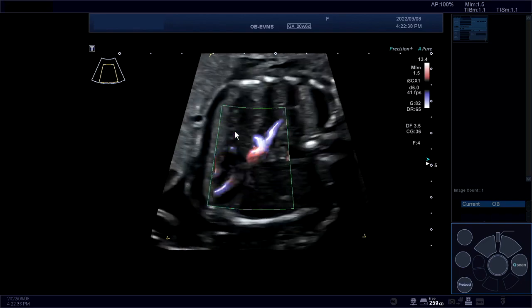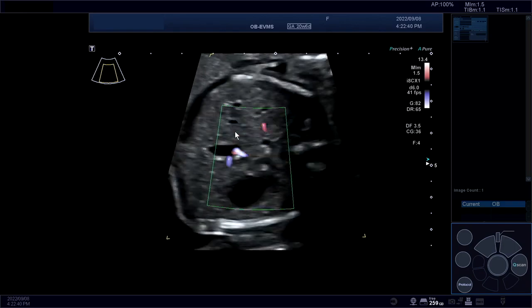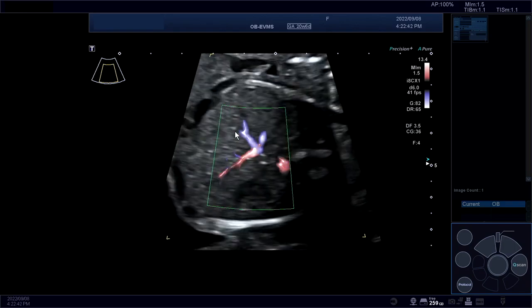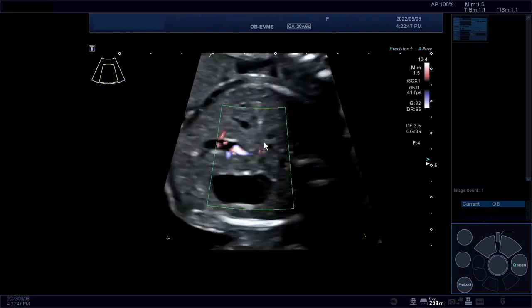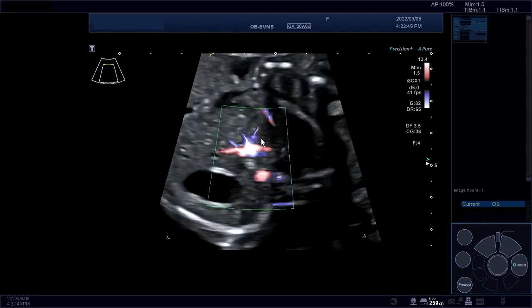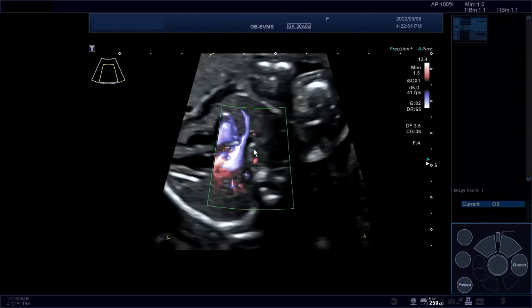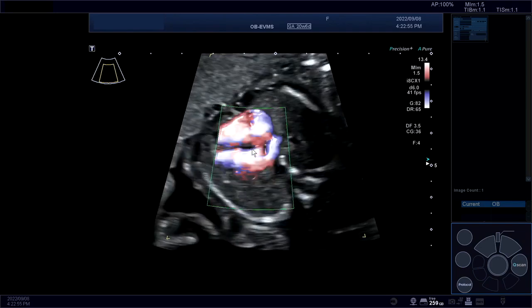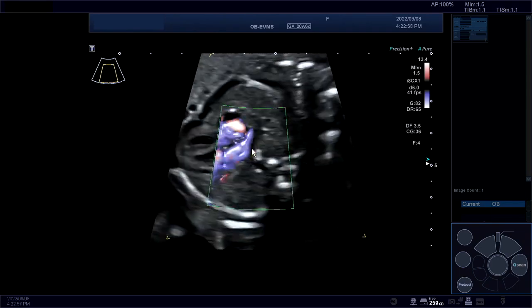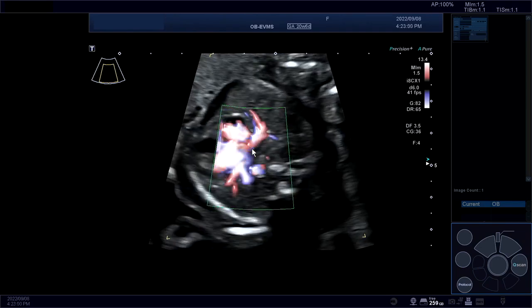So I'm going to remember, see my ribs on top. So I'm going to make sure I am in a perfect view. Here are the three hepatic veins draining into the inferior vena cava. So I'm subdiaphragmatic here. So let's go to the 4-chamber view. And you see here 2 pulmonary veins coming in.